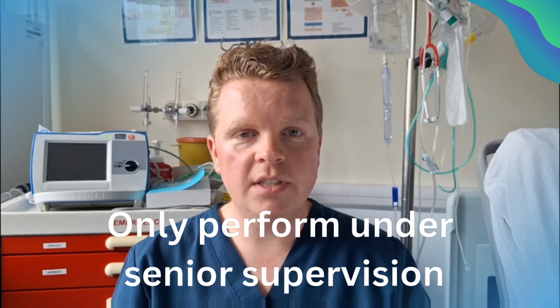You could also insert a peripheral arterial line, which will allow more adequate monitoring of their physiology. This is a tricky procedure and has risks of complication, so only ever do it under senior supervision.